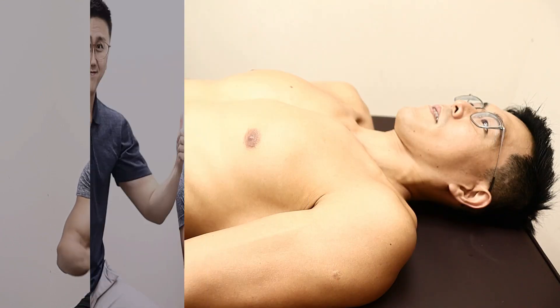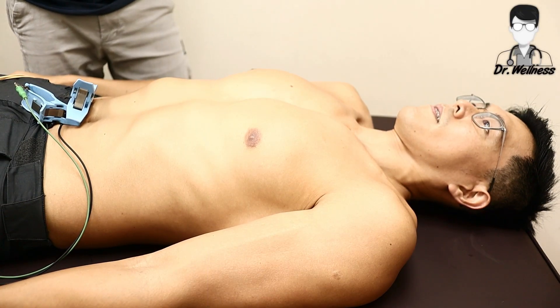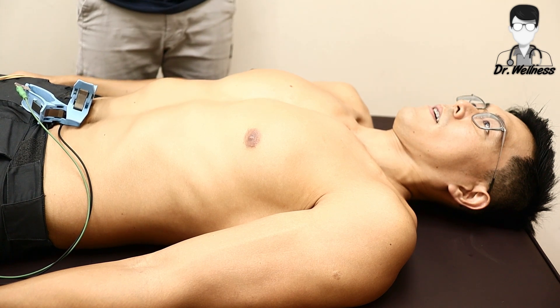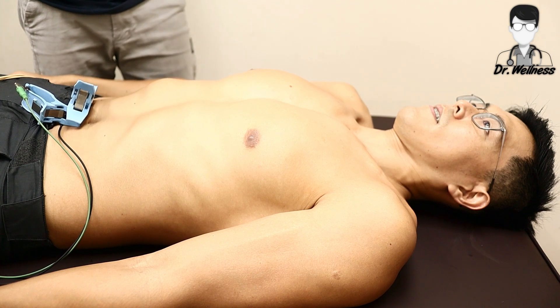So today we'll have Alvin here, who will be our model for testing out the ECG machine. Currently you're seeing Alvin lying on the treatment bed. I'm going to proceed to hook on the ECG chest leads.